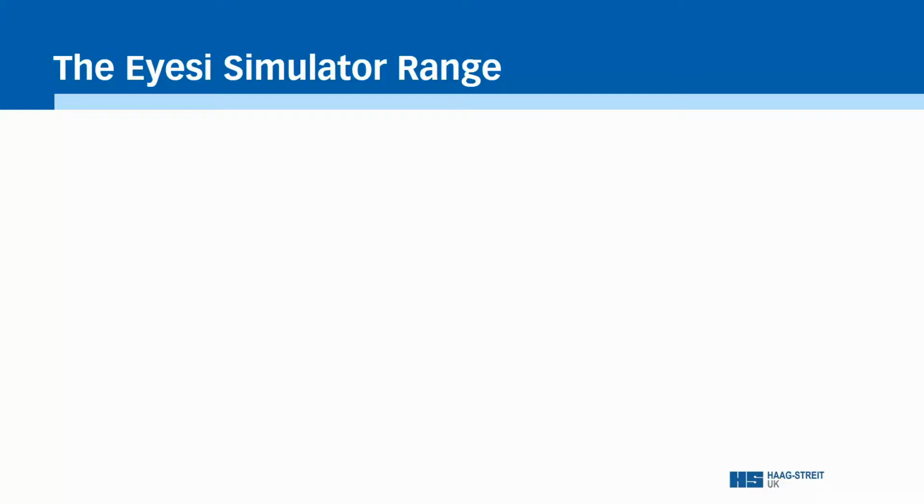The Eyesi simulator range is already well established, with more than 30 surgical simulators in the UK. Since April of 2020, VRMagic, the creator of the Eyesi simulator, has been part of the Haag-Streit group of companies, and at the end of March this year, VRMagic rebranded as Haag-Streit Simulation. Let's take a few minutes to watch a series of short videos describing each of the Eyesi medical simulators.